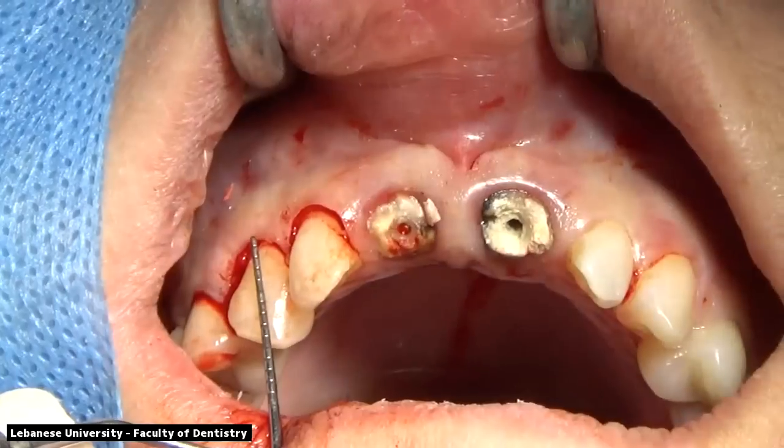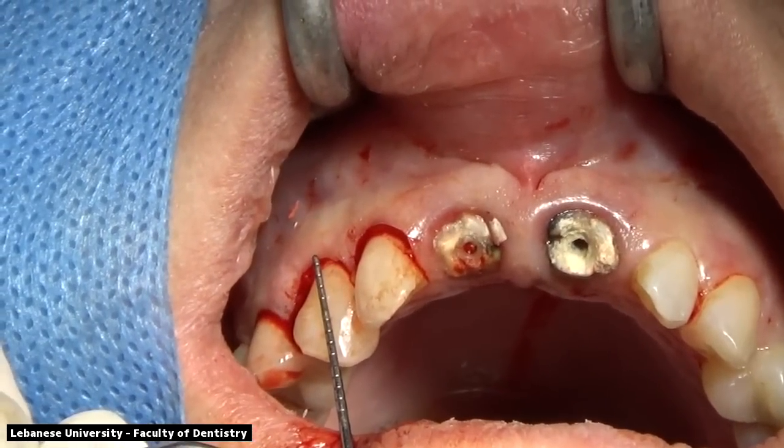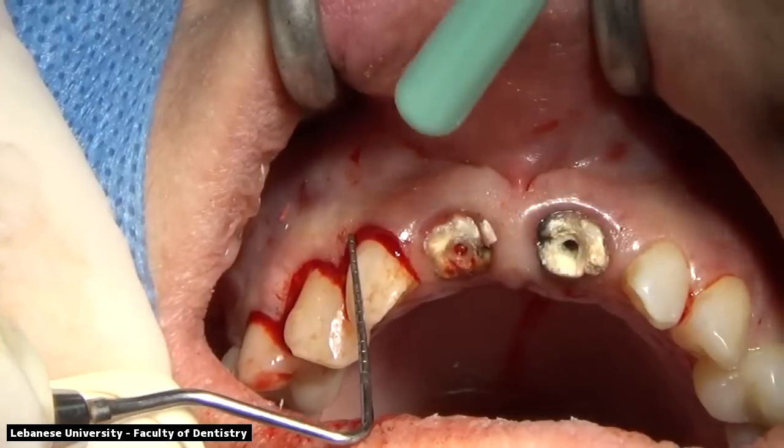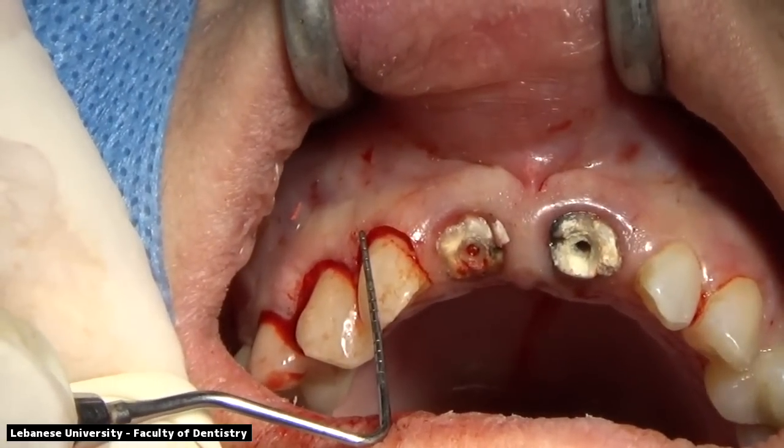We're doing our measurements to make sure our canine is at the 11 millimeter mark, and then the lateral incisor is almost at the 9 millimeter mark or 10 millimeter mark.